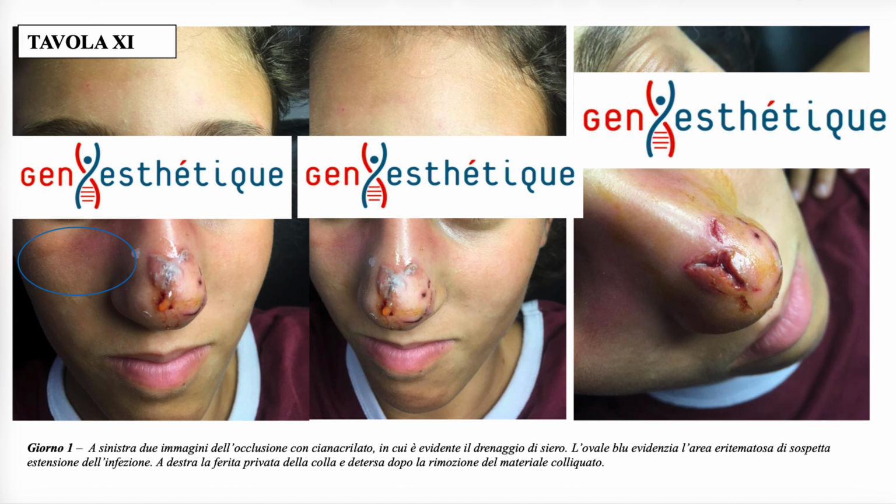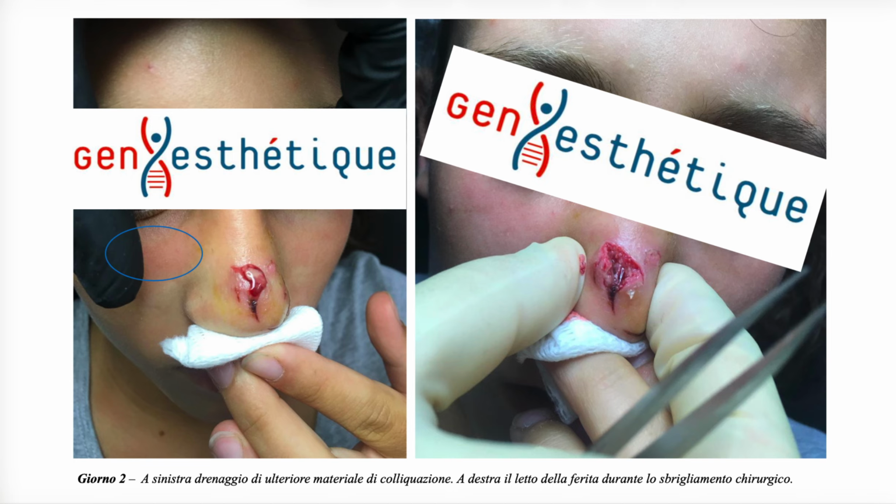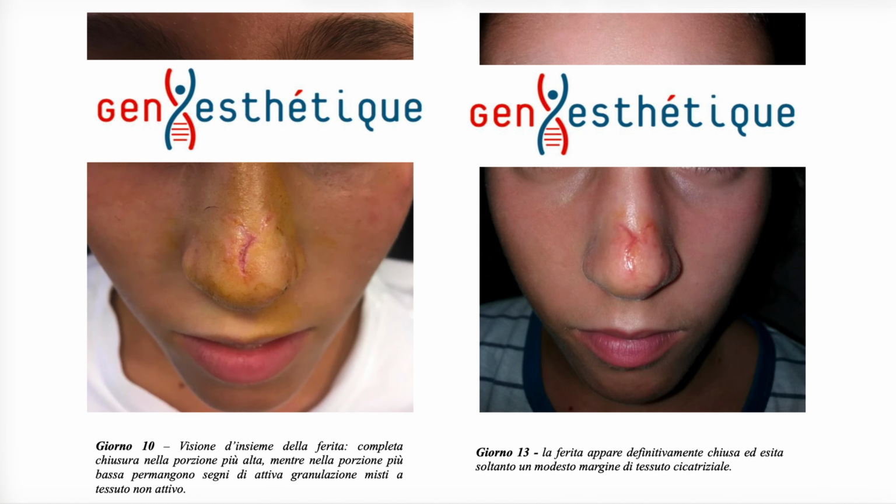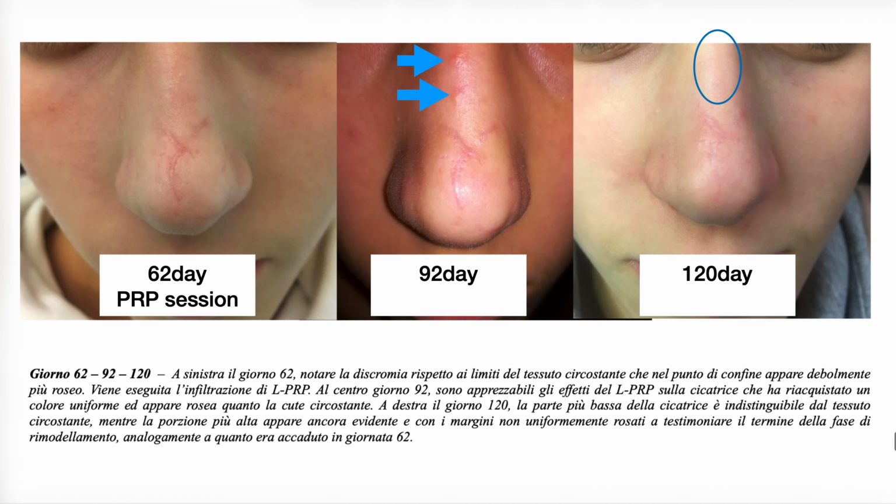This is another very interesting case, a dog bite treated with surgical glue, and I will avoid making comments. I treated it, and for the first dressing I had to pack the wounds with a coated vicryl suture soaked in povidone iodine to prevent premature closure. The wound healed by secondary intention.